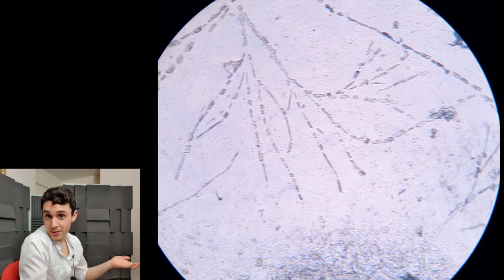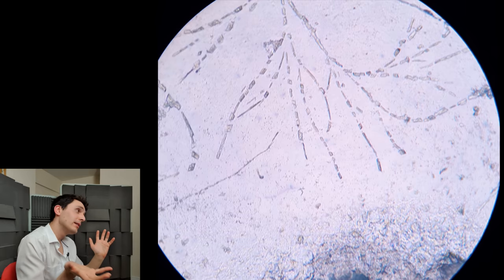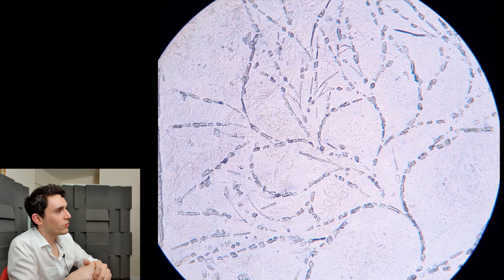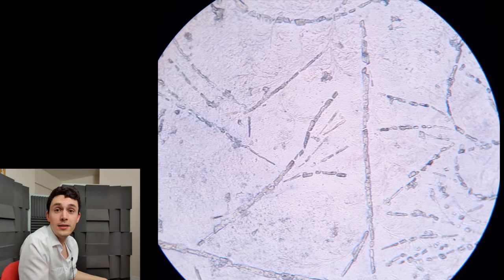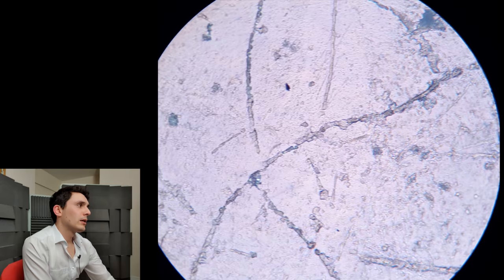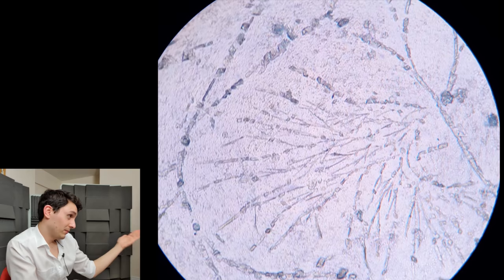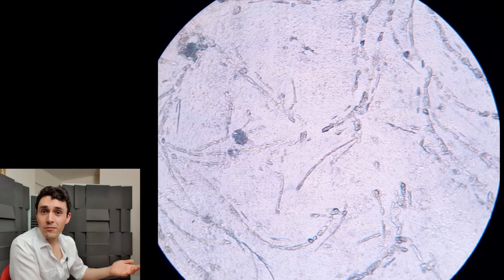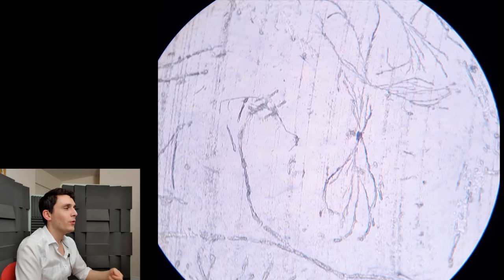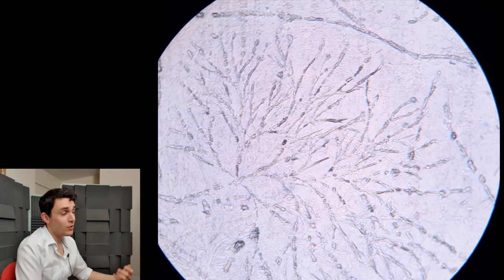Something is better than nothing. I rather suspect that when the patient does get a letter through from his local ENT department, look at that structure there — it's extraordinary, again broken up into segments. I could only get hold of 10% potassium hydroxide so I didn't really know how long to leave it on the slide. Usually this test is done with 20% potassium hydroxide, but I just kind of winged it. I suspect the appointment is going to be months into the future, and this can't really continue for much longer. He can continue coming to see me and I can routinely suction out his ears, but by suctioning out his ears I'm just treating the symptom, not the cause.